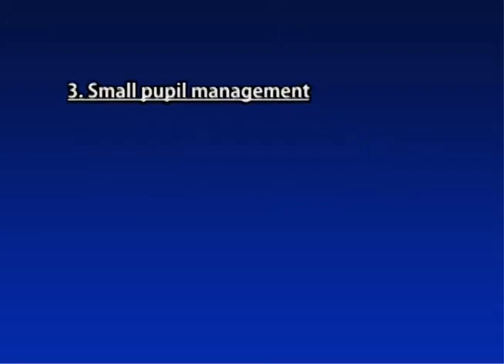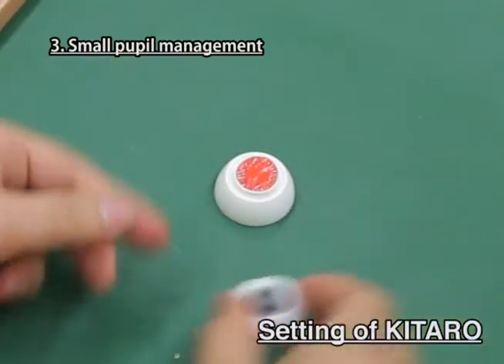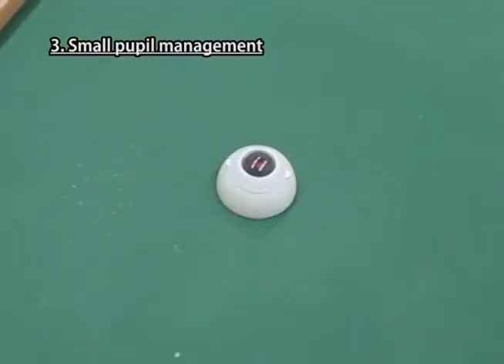Small Pupil Management. Settings of Kitaro. Put the lens for dry lab in the hollow of the scleral part. Fix the cornea iris part for small pupil management firmly onto the scleral part.